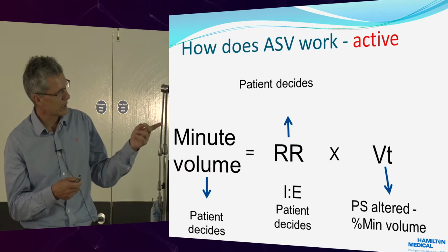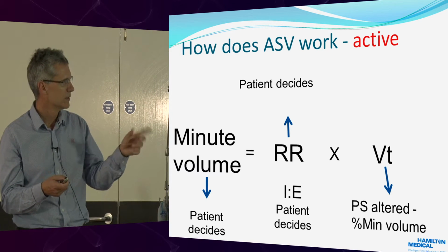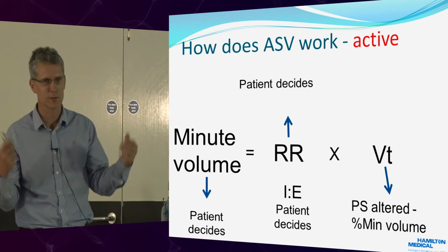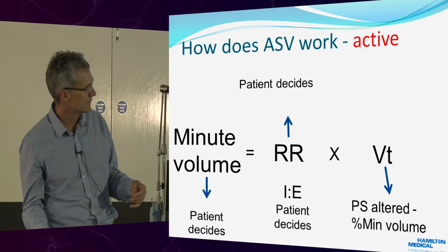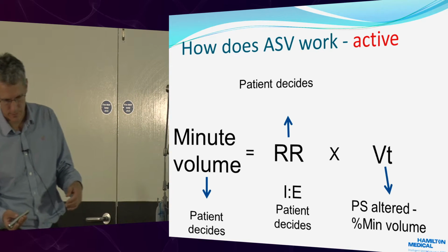Again, pre-Hamilton, we used to do this. Reduce pressure support by 1 every 12 hours or something. Yep, the ventilator automatically does this now for us.